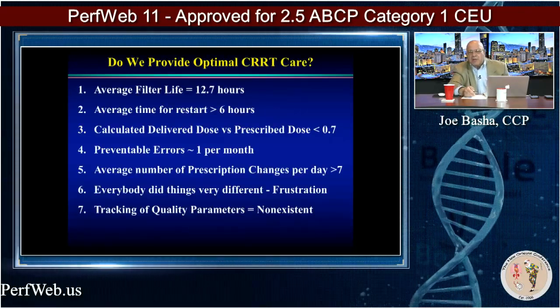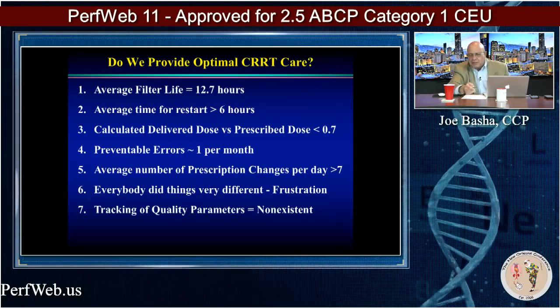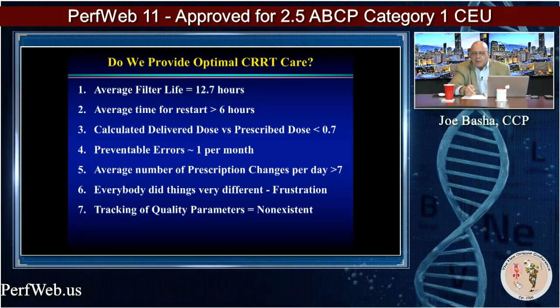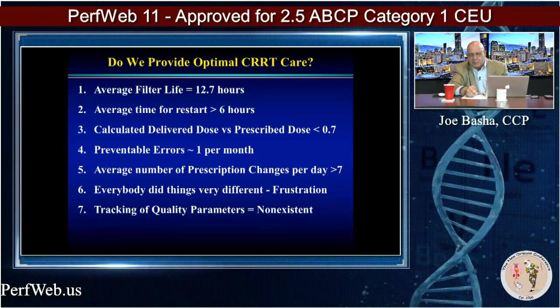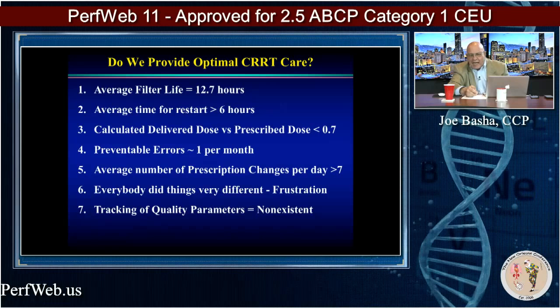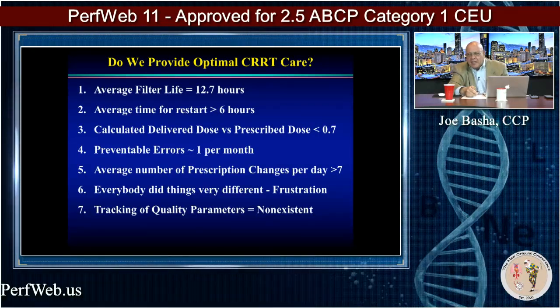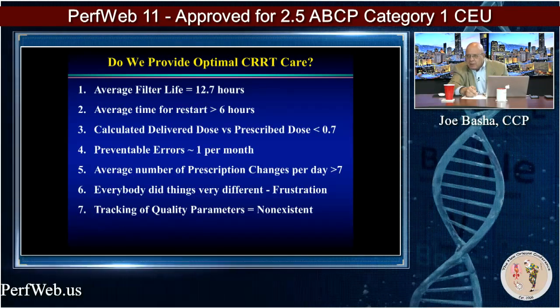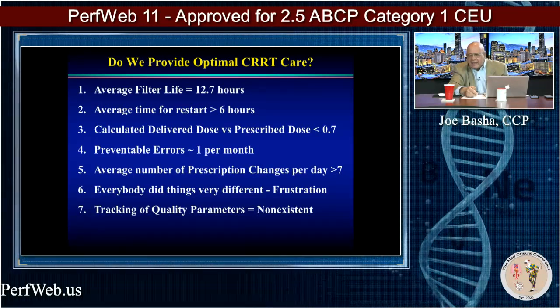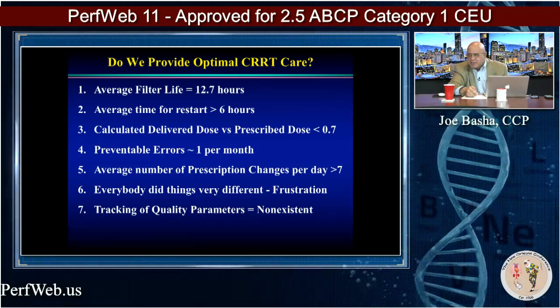Well, if your program looks like this, and I won't go through everything, you can read it yourselves, but if your program looks like this, you're not going to have a CRRT program. And this is not uncommon. And it's a big problem because it makes the therapy look like it is non-beneficial in the studies, and that really matters. When you do it well, the difference is remarkable.